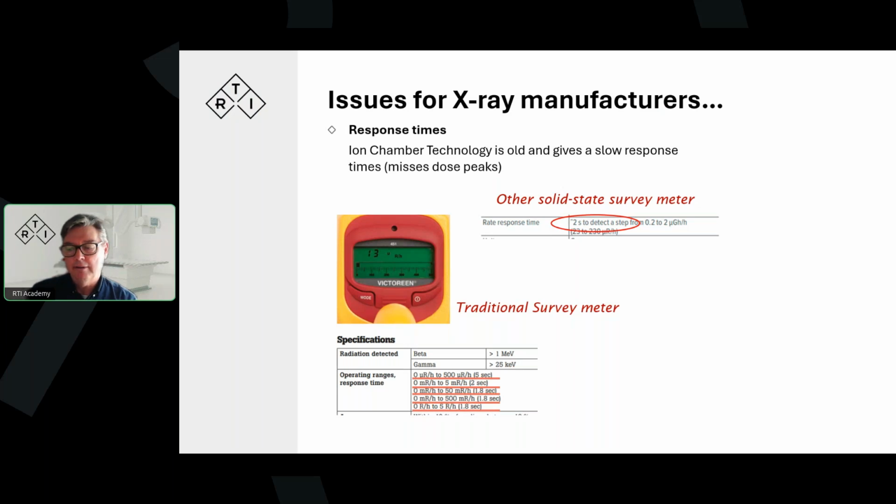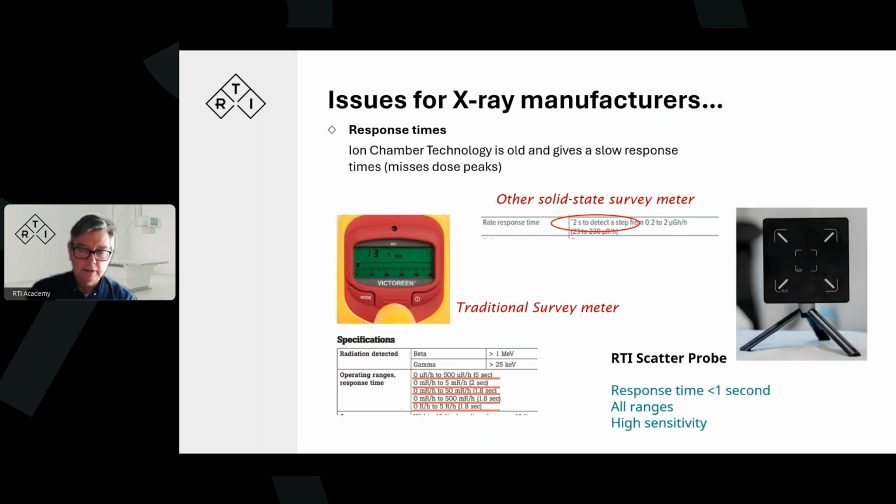If you're looking at isotopes in your nuke med department, or if somebody lost uranium or some other radioactive waste, which is just continuously emitting radiation, that's fine, then you'll be able to use that. But for shorter events like in medical X-ray, maybe even 1.8 seconds may not be fast enough, or you need to factor that in at least.